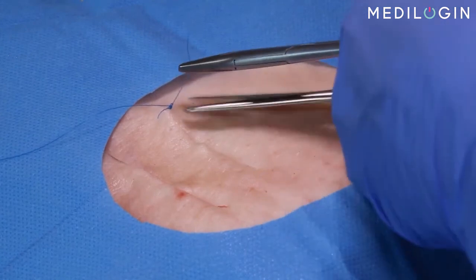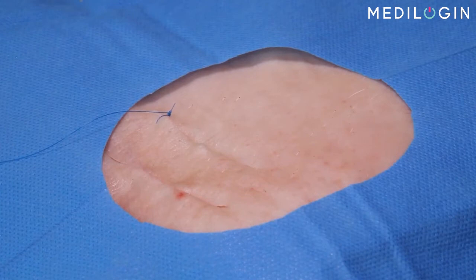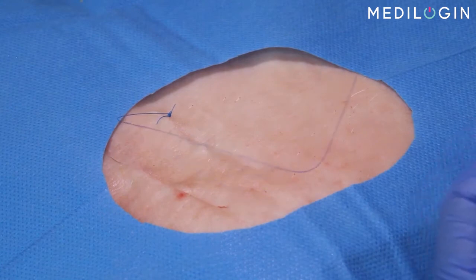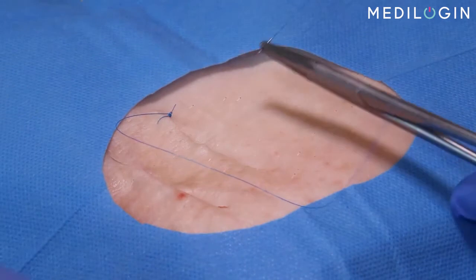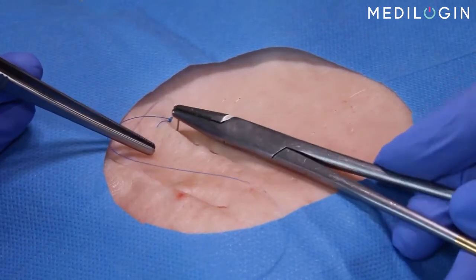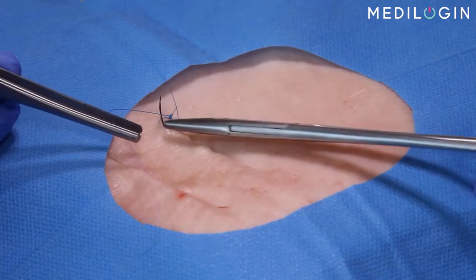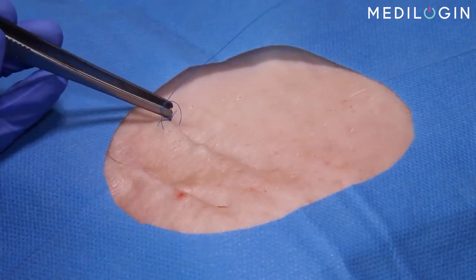Now only the short suture end is cut. The long end remains connected to the needle. Reposition the needle in the holder and continue as before without knotting. The needle is always inserted on the same side. After you have performed the insertion and removal with a supination movement, re-grasp the needle, tighten the suture, and reinsert it again a few millimeters below the prior insertion point.